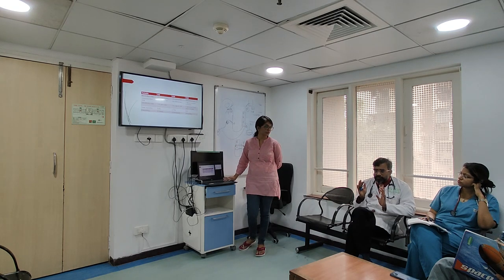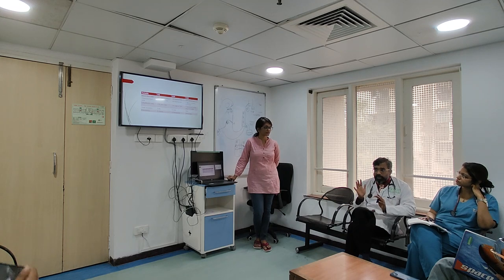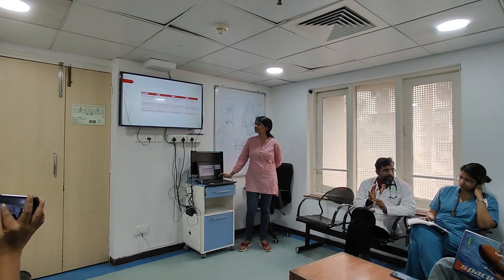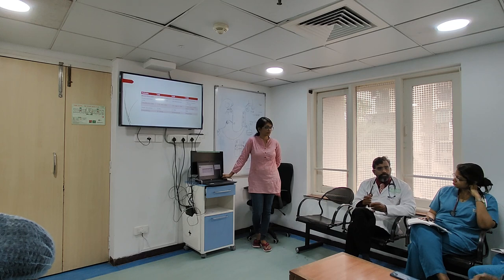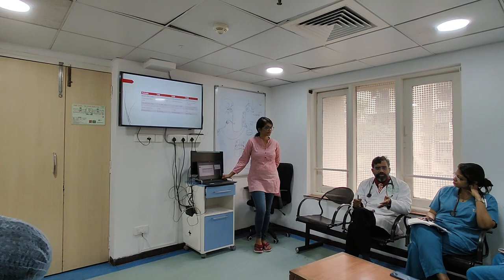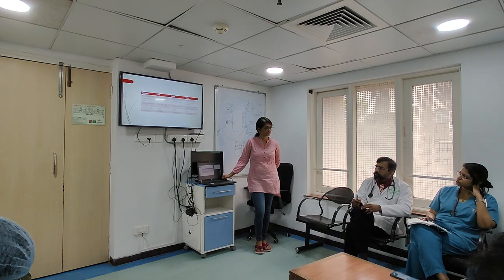So the answer is it is equivalent to CRRT. It is not that one is better than the other. CRRT and SLED, both are equivalent. There is nothing to indicate that CRRT is better than SLED. If you can do 6 to 8 hours of SLED in a patient, it is equivalent to a CRRT. The only problem is that you may not be able to do that in many patients. You may be able to do it in some, and not in others. In a grossly hemodynamically unstable patient, SLED becomes kind of difficult. You understand? But if you can do the SLED, it is equivalent to that of the CRRT.